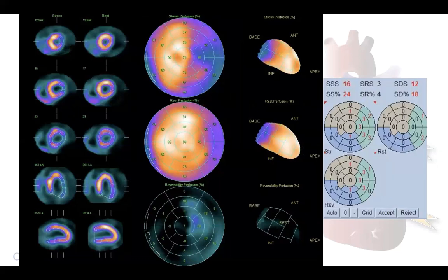But it's not enough, because we can quantify these perfusion abnormalities in a semi-quantitative way with a software that analyzes the amount of perfusion abnormalities compared to the peak of tracer uptake in one of the 17 segments of the bull's-eye. Here we found that the summed stress score is 16, which is more than 10% of the left ventricle. The summed rest score is 3, and the summed difference score is 12.